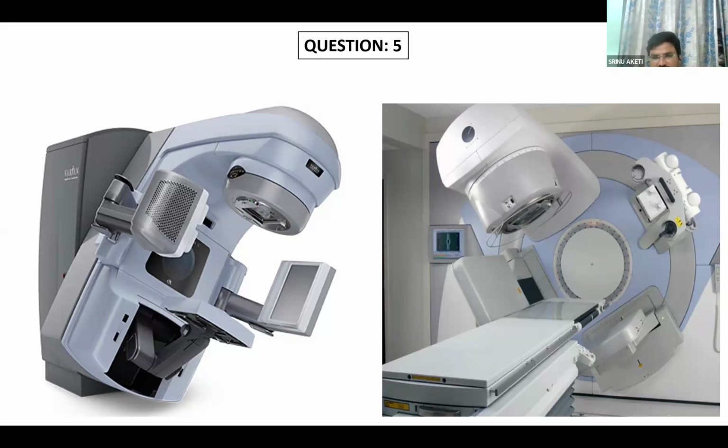So electrons, what electrons do you have? Oh, you told me that is a single energy machine you have. Yes, sir. All are gantry based, I mean, not like a linear accelerator, sir. Rotational gantry based. Initially, we had linacs, sir. I had seen 2 cases treated with electrons. It has different energies, sir, starting from 6 to 12 to 15 MeV. It was there, sir.